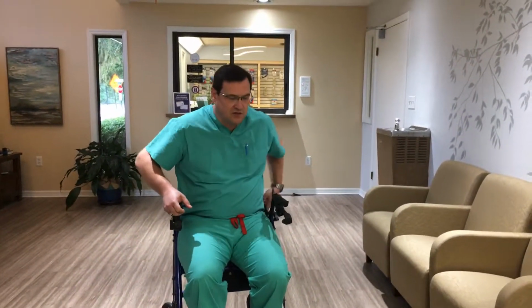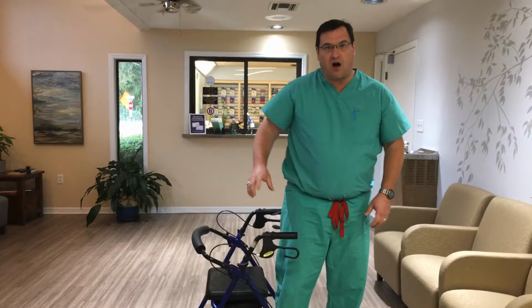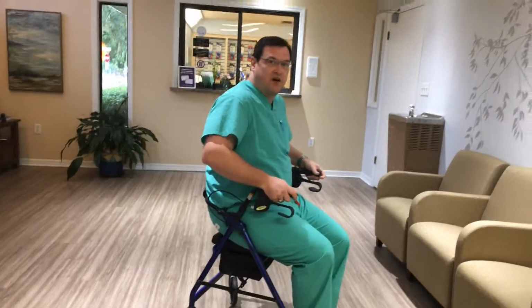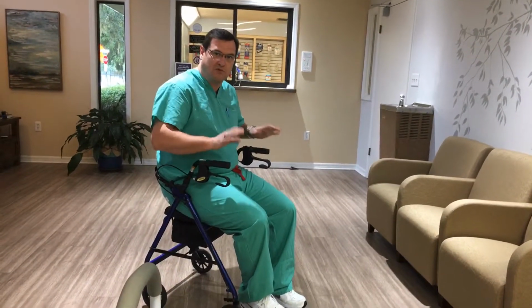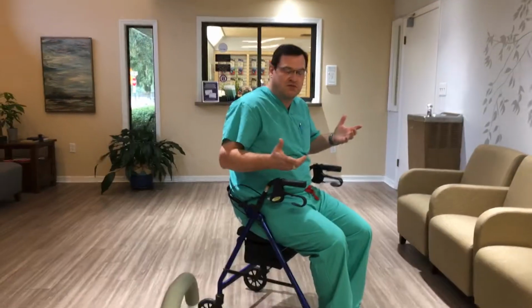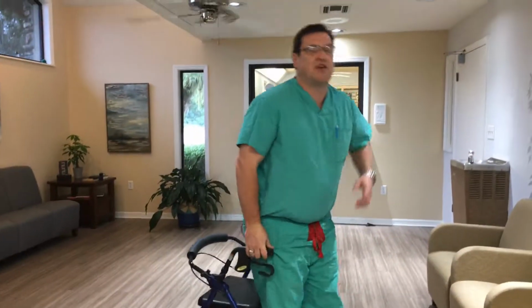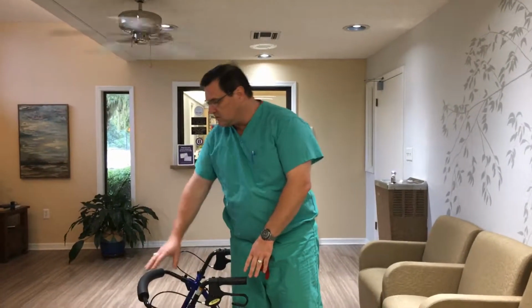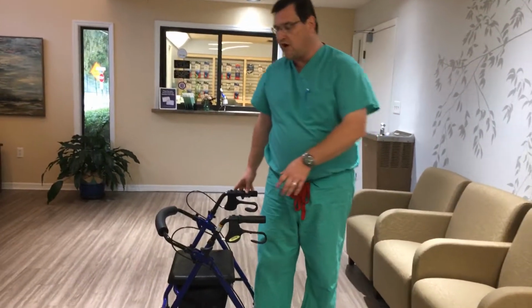Certainly you have to be careful that you make sure it doesn't have something on the back where you could fall off. So this one is designed to sit on. But once again, if you're scooting around and you tilt too far back, you might tip over or have a problem. So it's not designed for scooting around on, but some people will use it this way, which is why it can be beneficial to be non-weight bearing. You can do the same thing with a stool in the house that has wheels, but the problem with a stool that has wheels is often it doesn't have the back, and you can fall backwards if you hit something like a lip or something of that nature, or a rug that's preventing you from being able to move and get around to where you want.